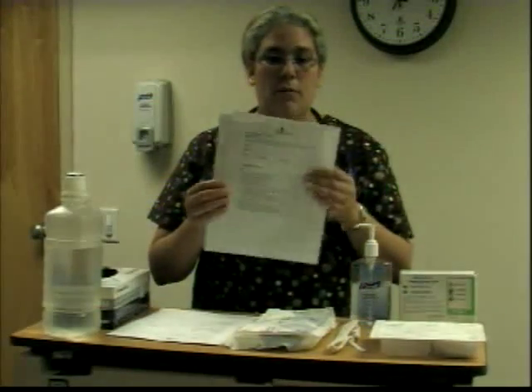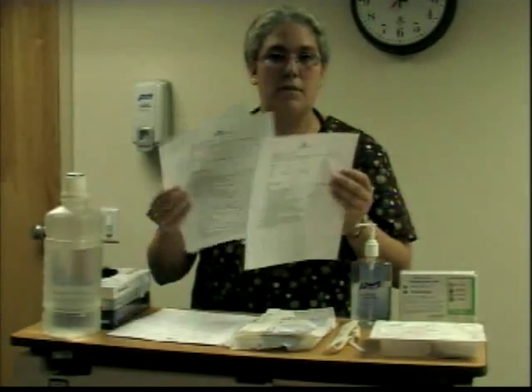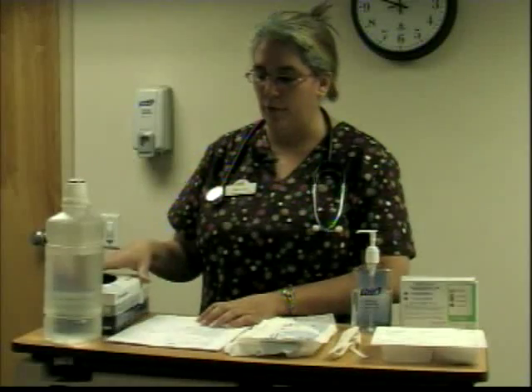Today we're going to discuss doing tracheostomy care as well as tracheostomy suctioning. Again, both of your checklists are on WebCT. You'll be able to refer back to them as you do your practices for your checkoff. So I will be using those as my guide today to explain how to perform both of the skills.